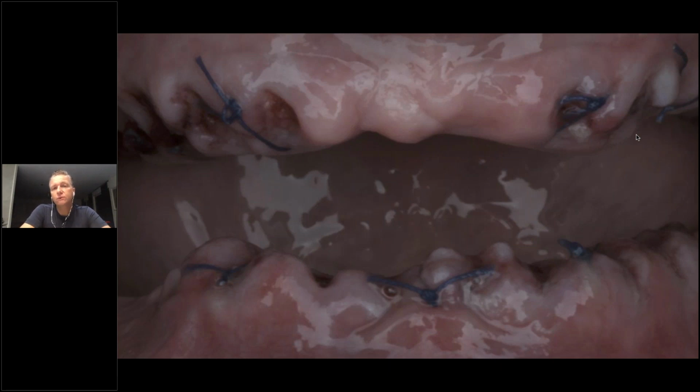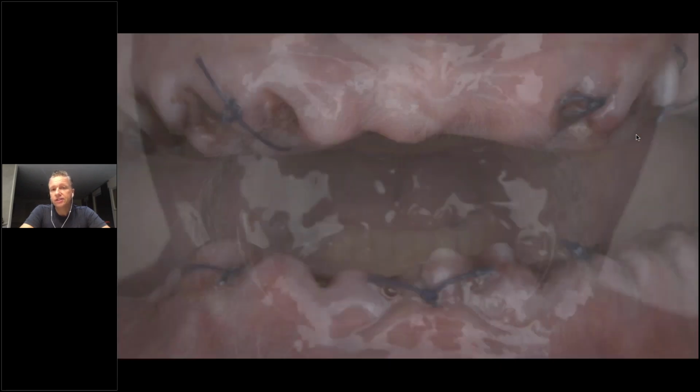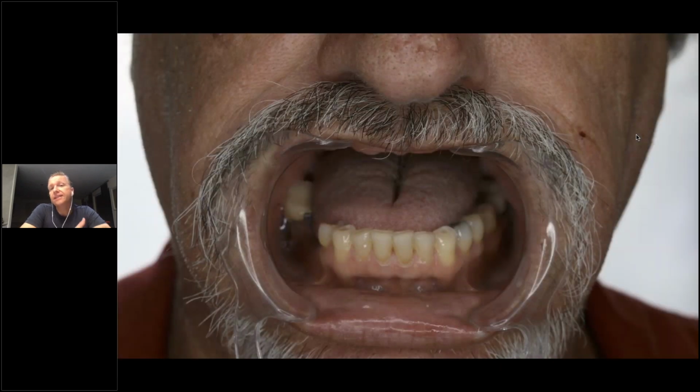So we're trying to fill an empty space with a smile. This patient, shown here, is edentulous on the upper arch. Of course, we're planning for implants for the future, but for now we have to fill the space first with a smile. So he will first get an immediate denture, or a denture in general, and then we transition to an implant overdenture, most likely.